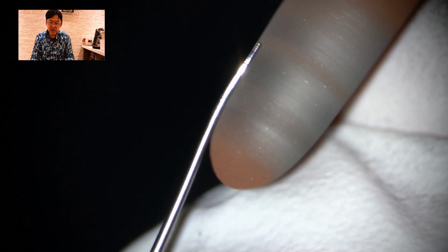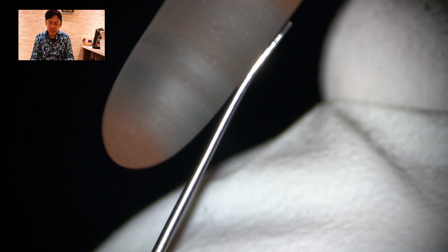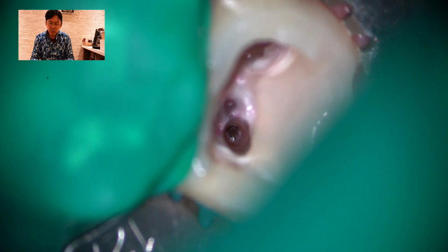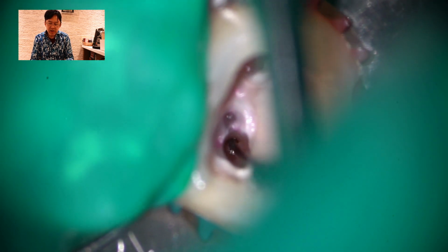So before I use the ultrasonic tip, I always sharpen the tip so I can be very efficient in making the broken instrument dance. The smaller, the better. You don't have to use high power to cut more dentin. Now, what I'm doing here is cutting the space deeper along the inner wall to make the instrument dance.